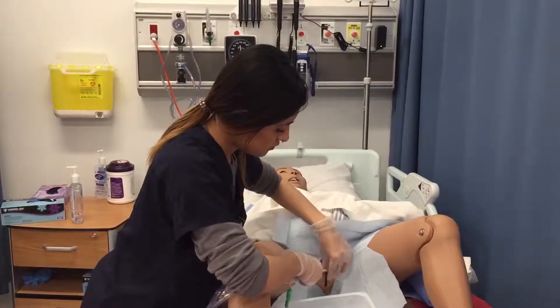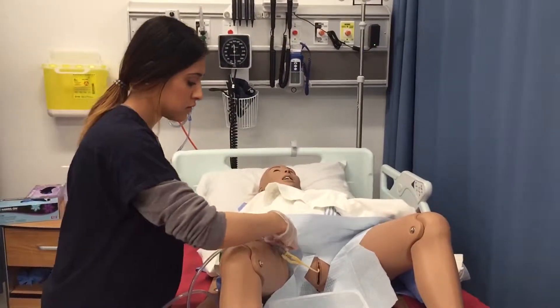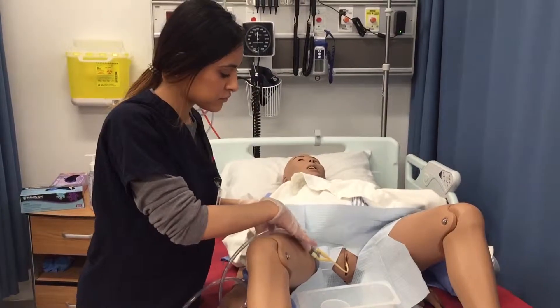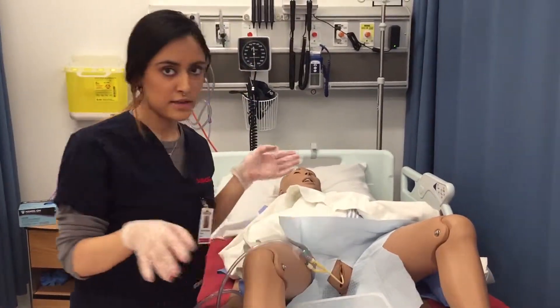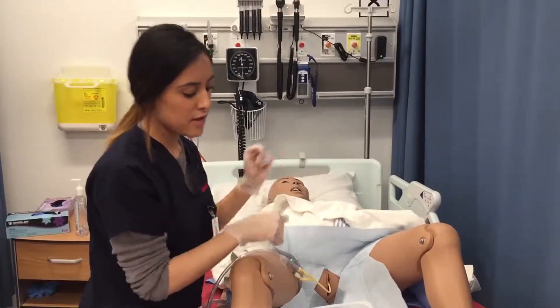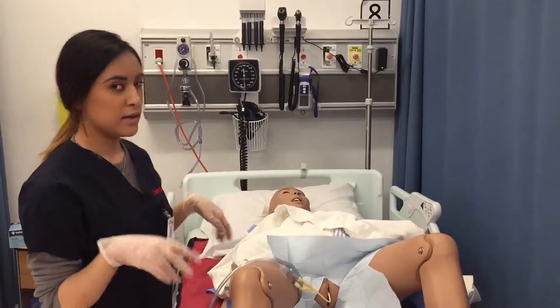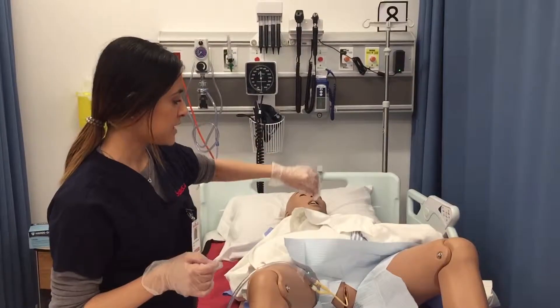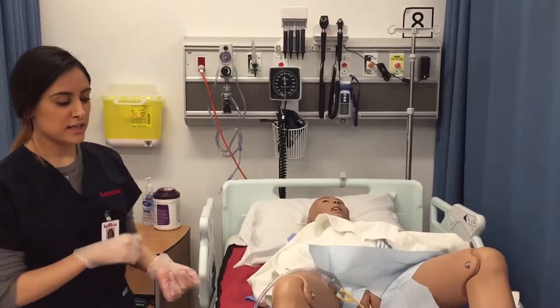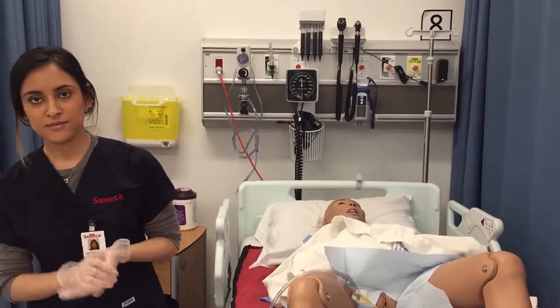Time's up — whoever had this skill is going to switch to the opposite skill. I'm just going to tape the catheter on. Now that I'm done, I'm going to remove all the extra draping. Before I leave, I'm going to make sure my patient is comfortable and has everything she needs. I'm going to put the call bell right by her bed. I'll take all this off, provide privacy, lower the bed, take off my gloves, sterilize my hands, and make sure everything's clean before I leave the room. Thank you.